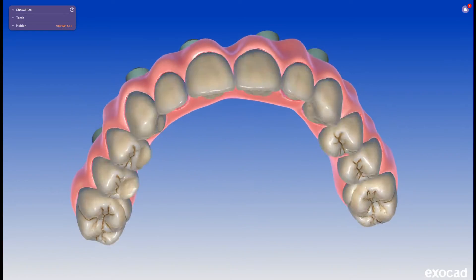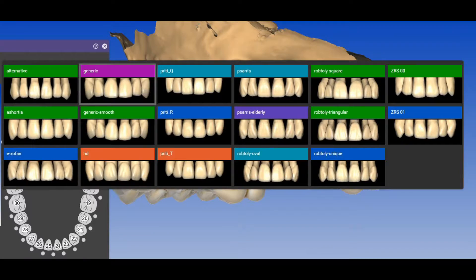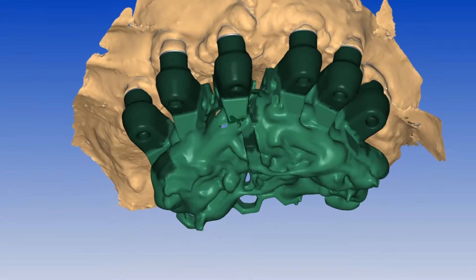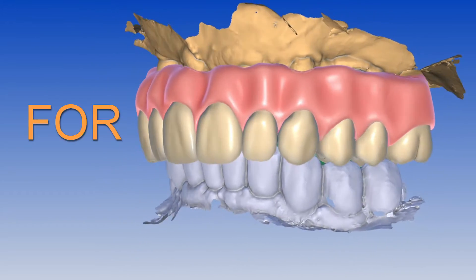This is a new Orlon X digital modelless workflow using Exocad, OptiSplint and Simple Crowns. You are not limited to the generic library anymore and today you will learn how to use any tooth shape. At the end of the video you will be able to design these cases too, and I will give you the scan and Exocad files for free.